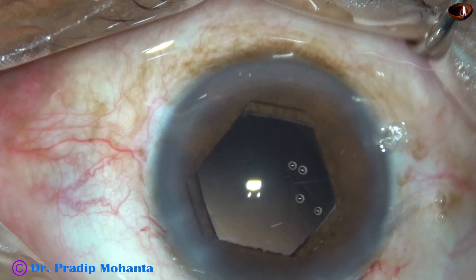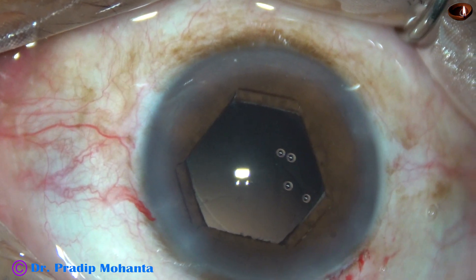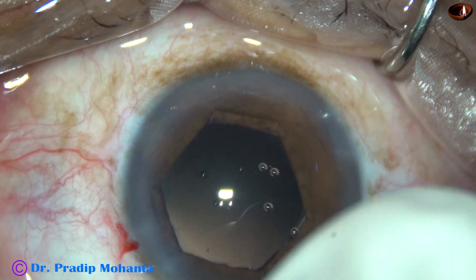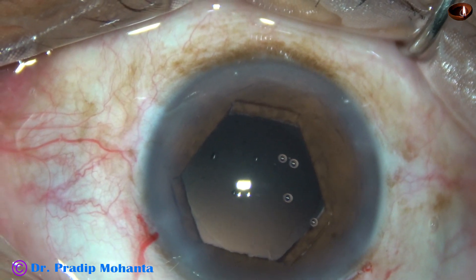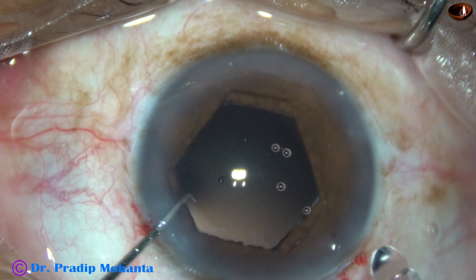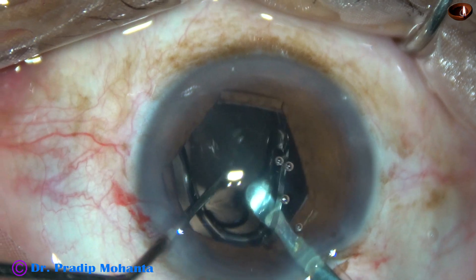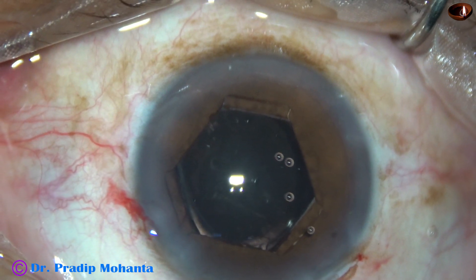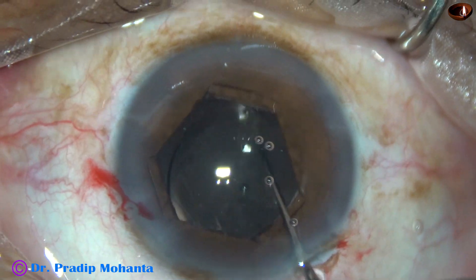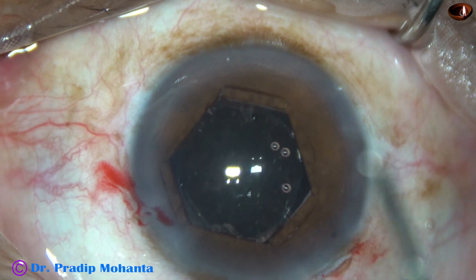Now it is time to implant the intraocular lens. The anterior chamber and capsular bag are filled with Viscoelastic — this is 2% HPMC. A single-piece monofocal intraocular lens is implanted in the capsular bag. The lens has gone into the capsular bag. Now the lens is dialed to place the haptics 90 degrees away from the main incision.